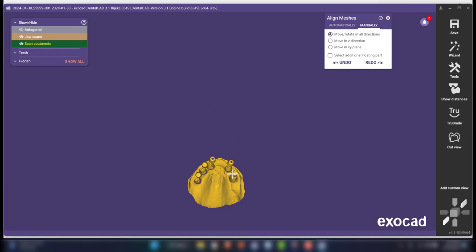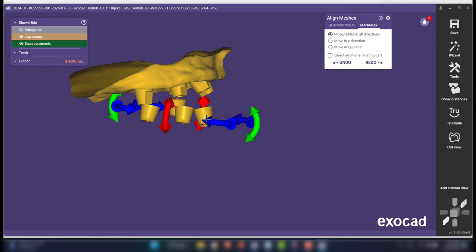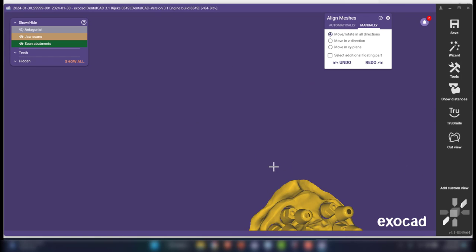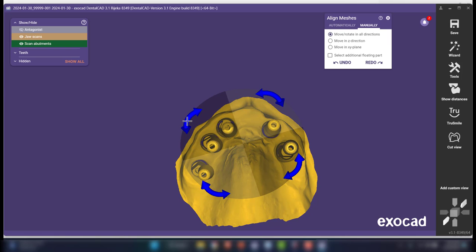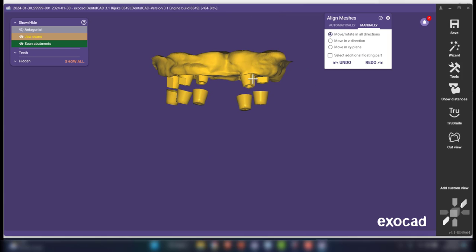So in manual, I can just pull these over in the same proximity to one another. All right. If I wanted to just rotate this scan, because I don't want to rotate this one and pull it out of its orientation to the lower, then I just hold Control while I'm hovering on it and the widget pops up. So I'm just trying to get these pretty close to one another. And that's probably good enough. You know, I could maybe do one other thing, which is rotate that. All right, so I'm pretty happy with that. This is just going to make the stitching a lot easier, but I can't do the actual stitching that way.